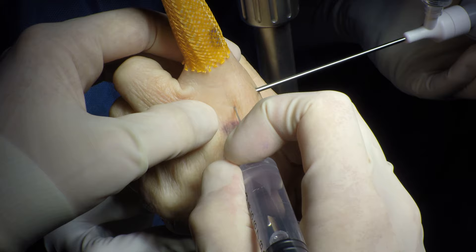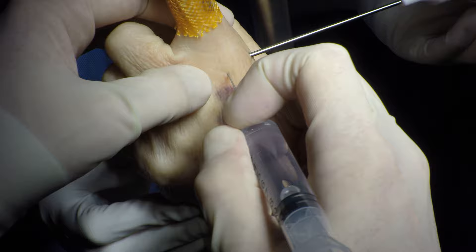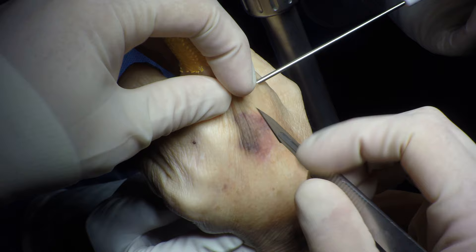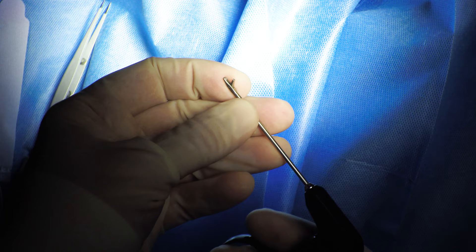There is some debris in the joint, but there does not appear to be a significant amount of exuberant synovium. A 22-gauge needle is then used to mark the location of the working portal. Proper position is confirmed in the joint, and the skin is incised. A blunt trocar is then used to penetrate the joint.